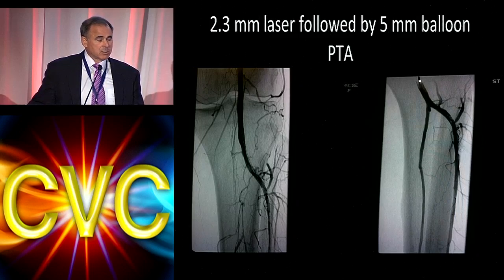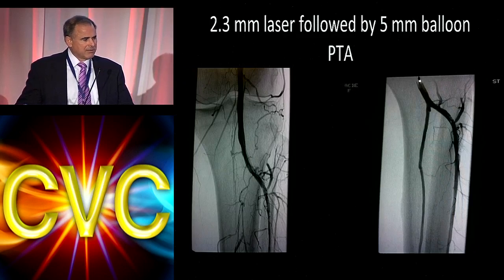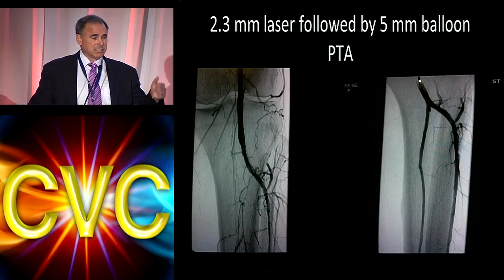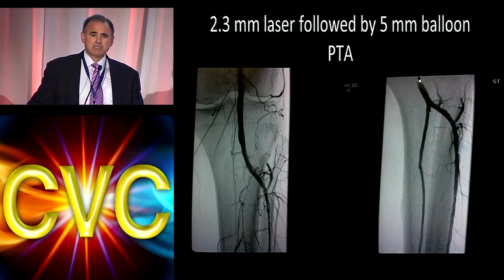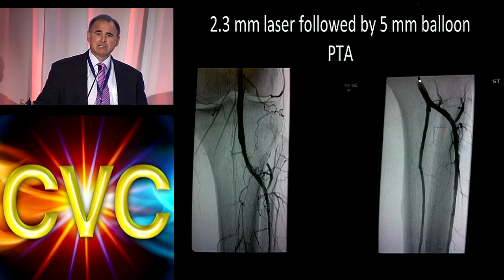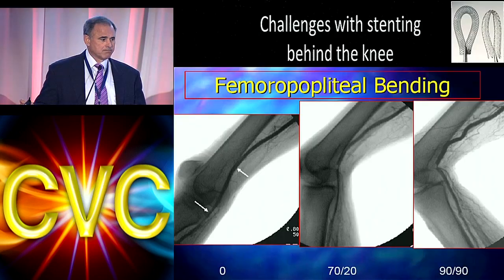Now, could you do this with other atherectomy? Of course you could. And I think which one you use is dependent upon the presentation. Do you think there's thrombus? How densely calcified is this area? And your level of expertise. I happen to like laser in this area because I think it has a little less embolic debris.